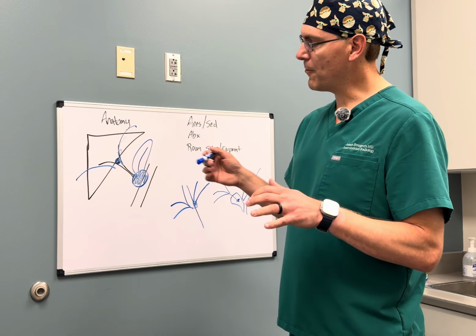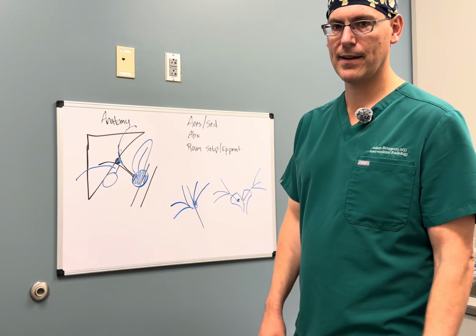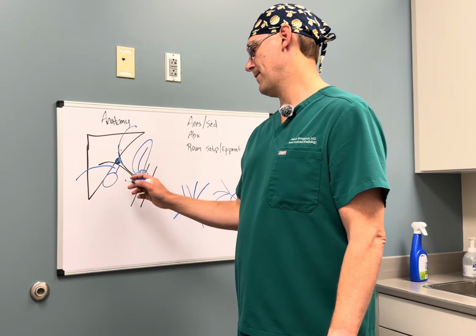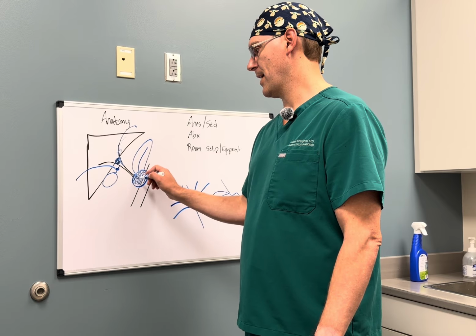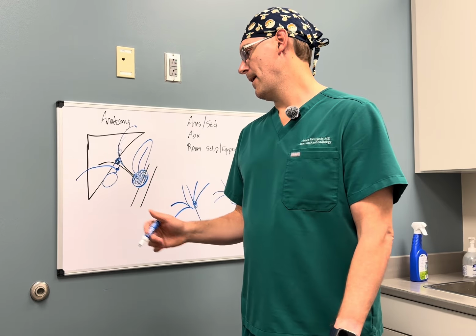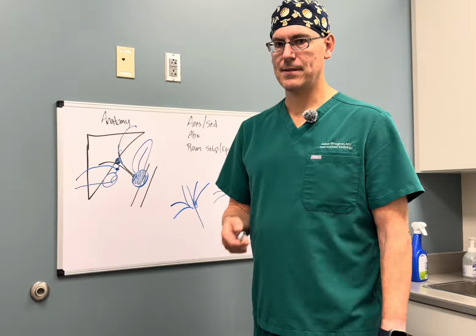I would point one more thing out here, that the gallbladder is a reservoir that's coming off the common bile duct near this confluence. And if the gallbladder can't drain because of stones, or occasionally if there's a blockage distal in the common duct and the gallbladder gets dilated and infected, then we place a drain called a cholecystostomy tube, and that's less invasive.